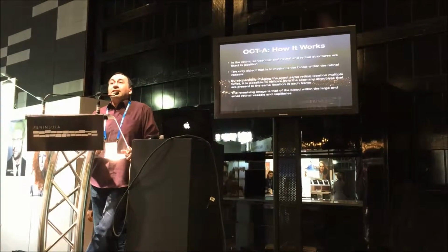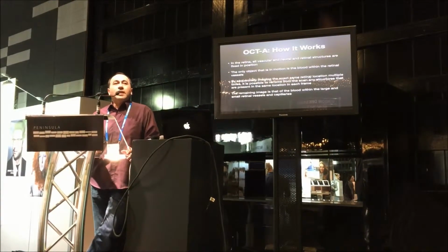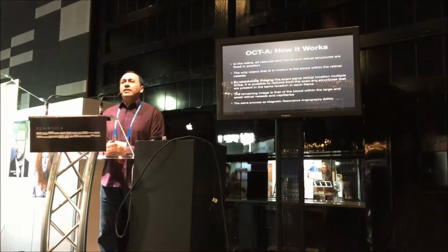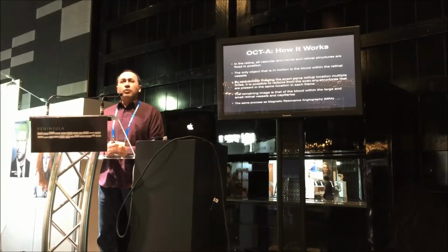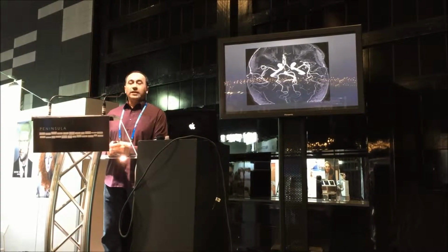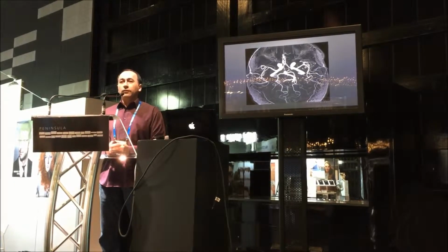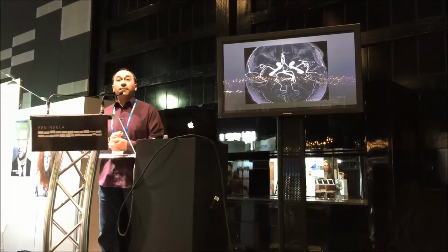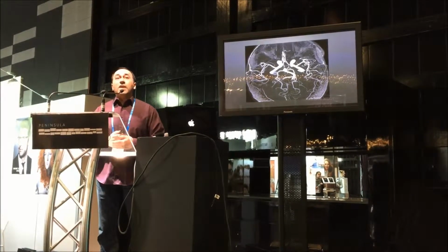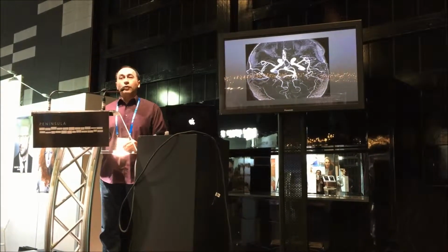Once we subtract any stationary images away, all we're left with is the blood flow within the blood vessels. It's really the same process that our medical practitioners use in MRA scans, where you get imaging of the blood vessels, so that's the circle of Willis, again using no contrast medium, no dyes, just using MRI technology to take sequential images.